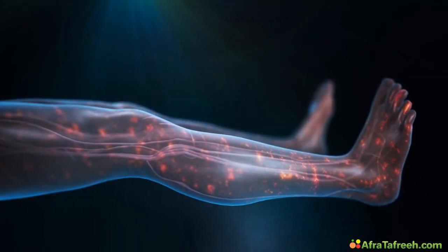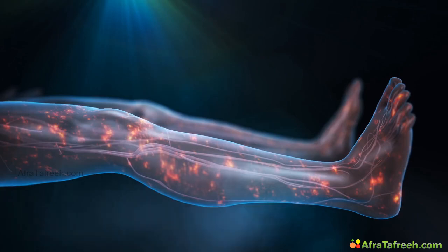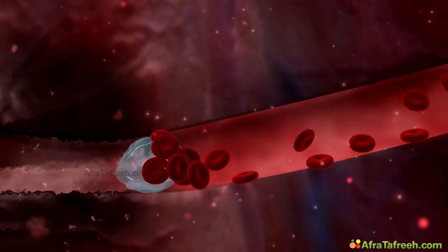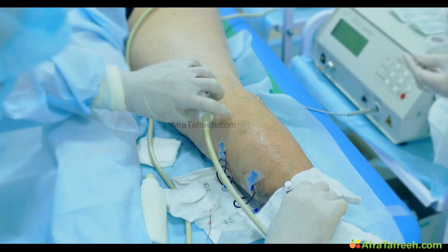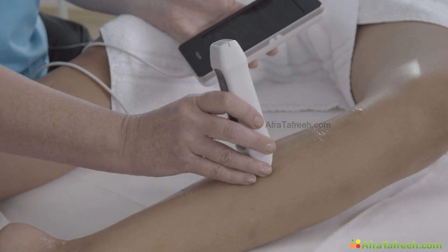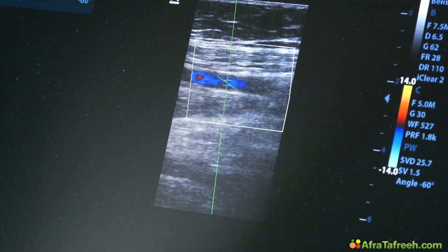Patients presenting to the primary care physician or emergency department with lower extremity symptoms suggestive of venous thromboembolic disease require a diagnostic evaluation. It is important to rapidly diagnose DVT, allowing for immediate treatment with reduced chances of pulmonary embolism. Although contrast venography was the diagnostic standard, this has largely been replaced by ultrasound as the first-line imaging modality. The accuracy of examinations increases with increased clinician ultrasound experience and training.